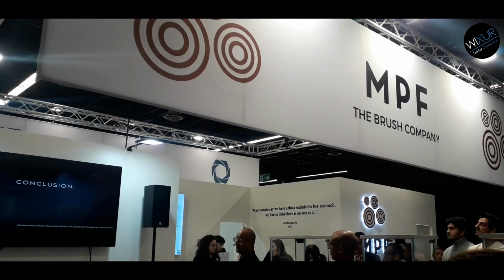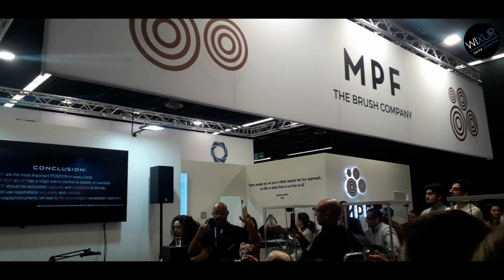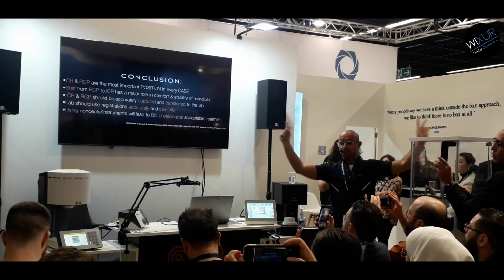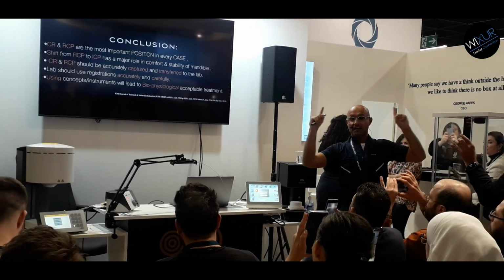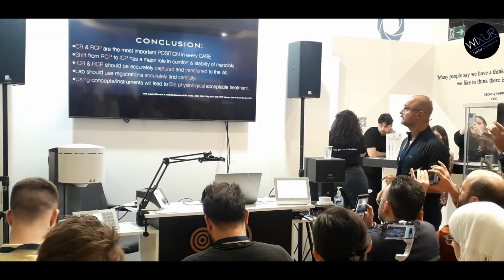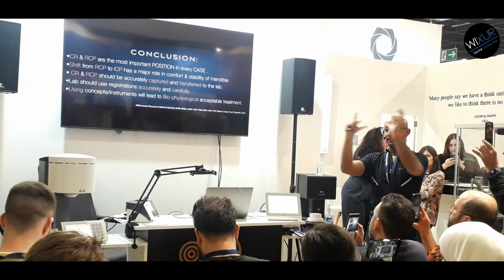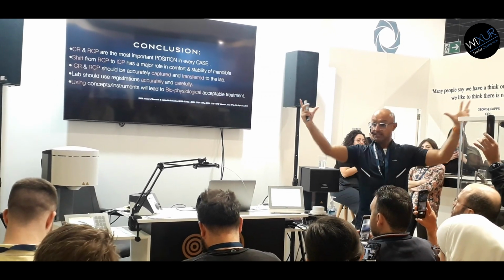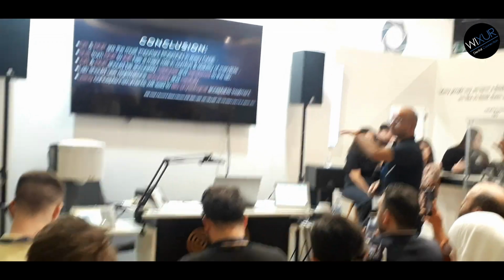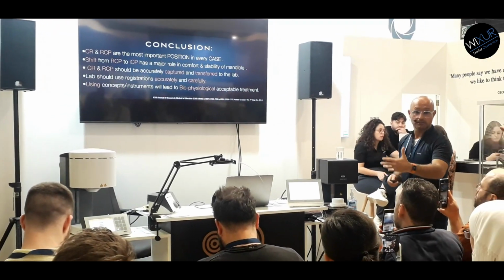Conclusion, very important. CR, retruded contact position, and ICP, intercuspal position, are very important. We have to register both, because there is a shift in between. A dentist should take care of this information and provide it to us. We as technicians should take care of this information and put it in our work. There are many systems and many instruments to do the work right, so do it right.